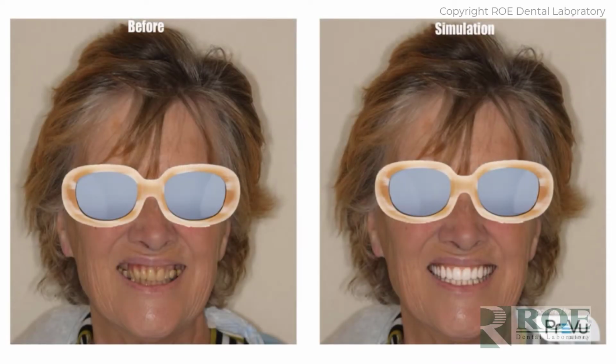This video will cover a standard Chrome guided smile case from start to finish. We'll go into some details about the particular case and some techniques, but for the most part this is going to be a pretty straightforward case with a little bit of a twist on how the doctor treats the labial tissue on this case, on his technique.